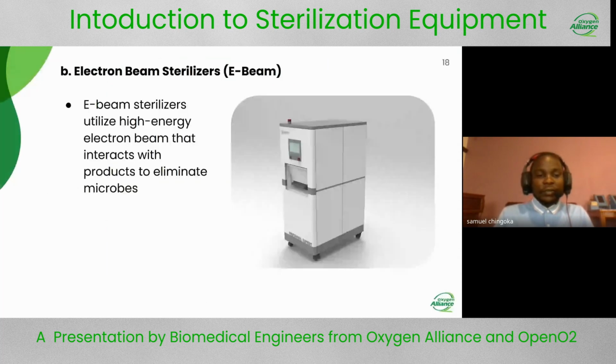So this is a setup of a large setup, like the manufacturing setup. We also have the electron beam sterilizer under radiation sterilization equipment.